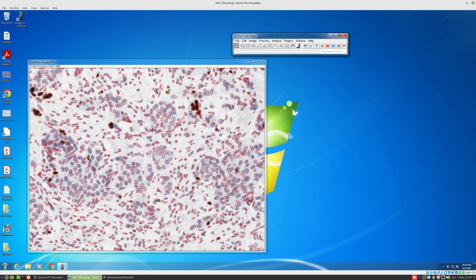So we have this nuclear segmentation, and the next step we'll do is some sort of classification based on the area of the nuclei and the circularity of the nuclei. What I mean by that is the stromal cells, for instance, are frequently elongated, which means their circularity is low compared to tumoral cells, which might be higher. And also the size will play a role in this classification.